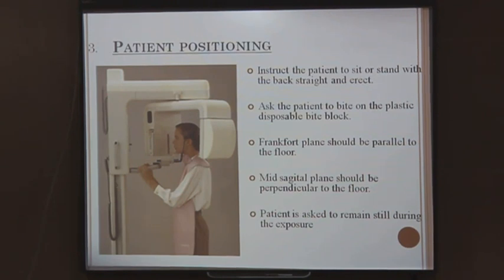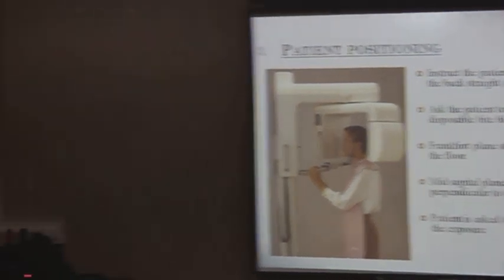If the Frankfurt plane is not parallel to the floor, what will be the radiographic artifact or error? Say suppose the patient's head is tipped down, then what will be the error? You understood my question? Something to do with the smile.